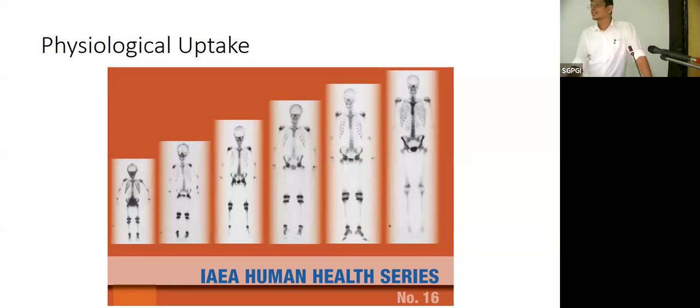So there are atlases over there, but unfortunately atlases were made 20-30 years back, and now the bone age, I don't know why it is changing, but the age is entirely different now. So the fusion and everything occur much earlier. So if you are imaging for osteomyelitis or something like that, then you have to clearly see whether it is physiological or pathological. But now we do have specialty, so it is much easier.